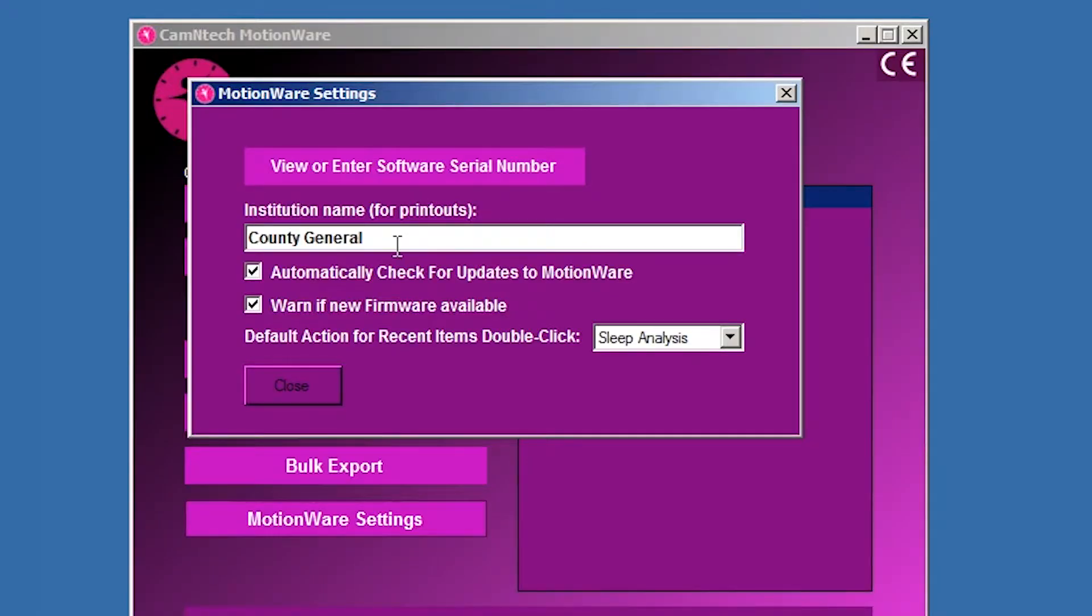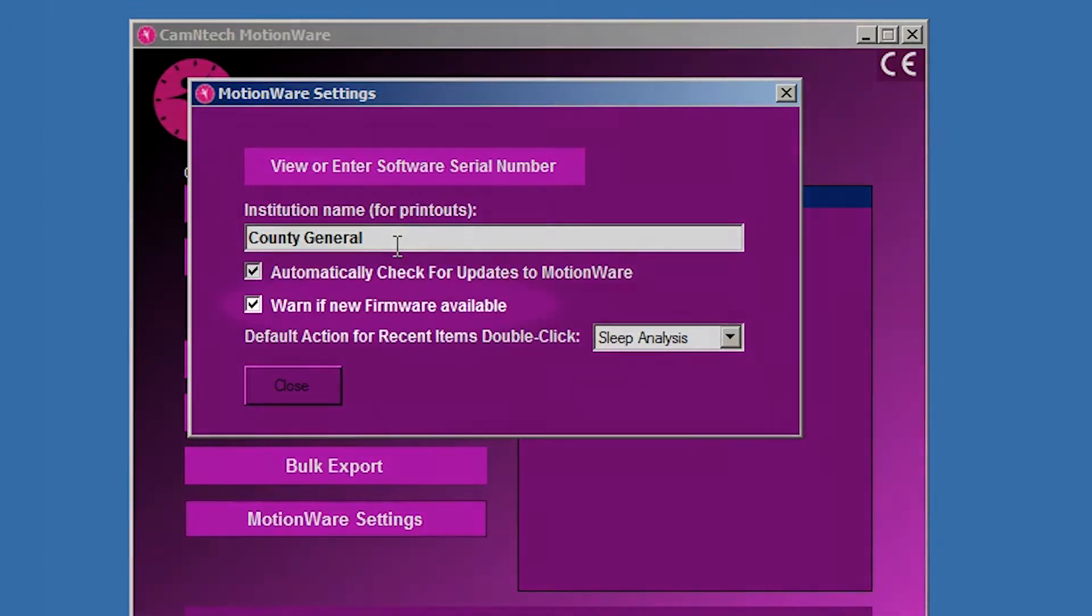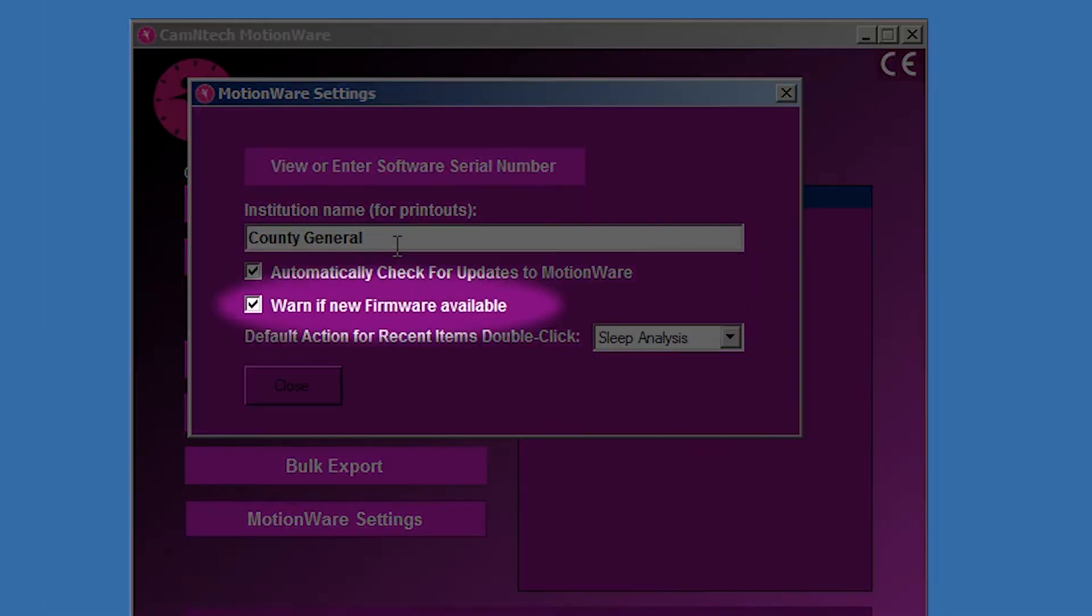New firmware is sometimes provided within the software update. Check the Warn if new firmware available selection to be automatically notified if new firmware is available. It is recommended to check and update the Motionwatch firmware following a software update.